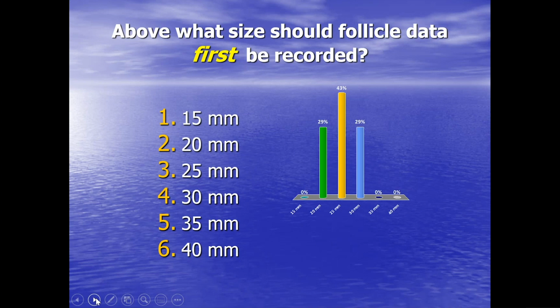Now, let's just say here, for the purposes of this presentation, we're talking about a thoroughbred mare or a warm blood mare, not particularly heavy draft horses and not particularly smaller pony types. You'd have to adjust the follicle sizes. So let's go with thoroughbred or typical sized warm blood mares. Now, I would be in the 43% category, but as I say, no right or wrong, but I record any follicle over 25 millimeters.